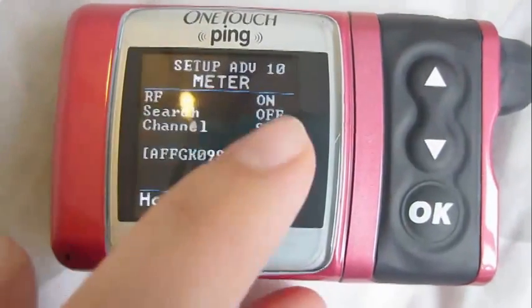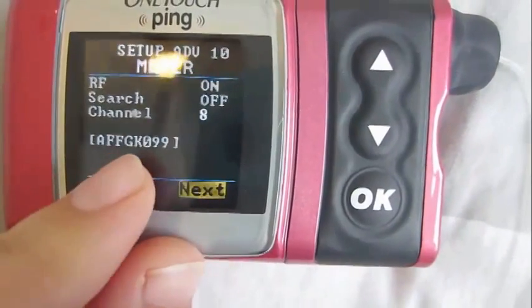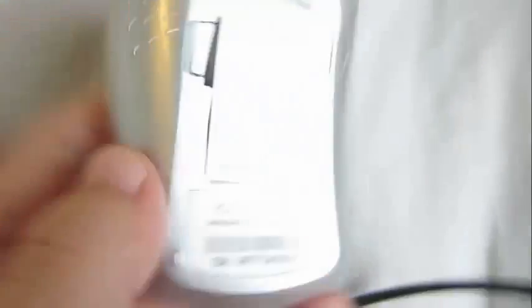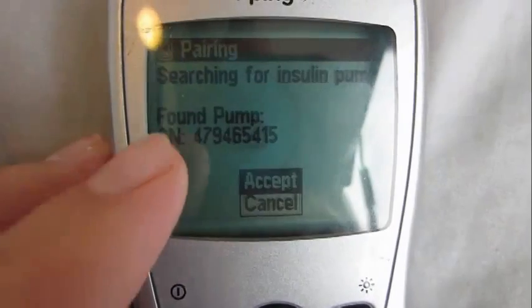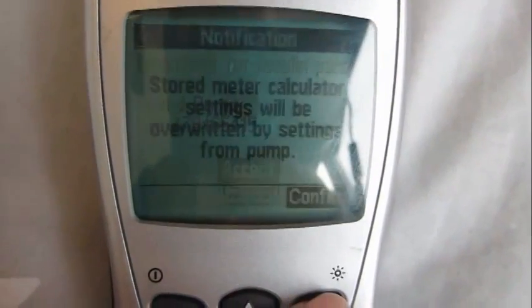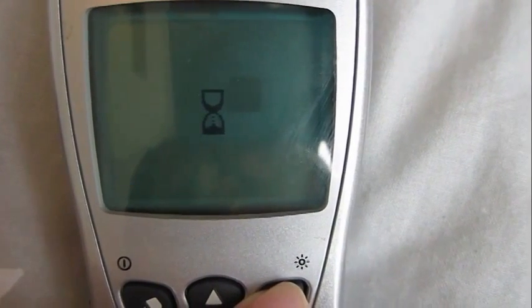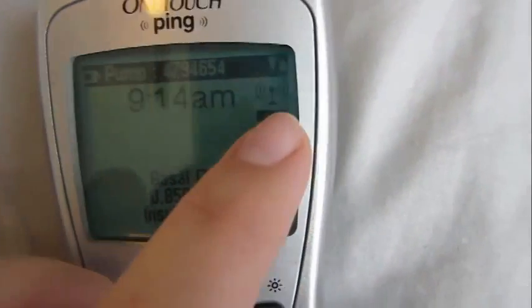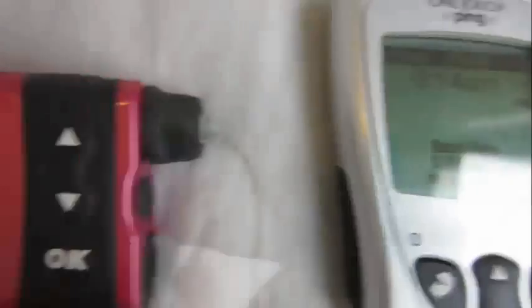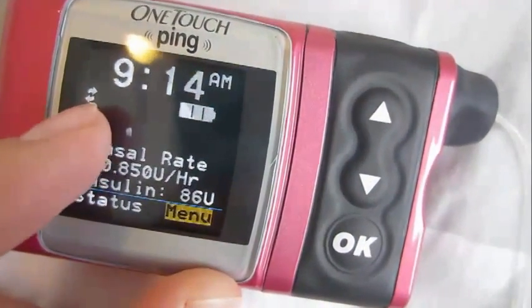Anyway, so now it says the RF is on, which is the search feature. Search is off because it already found the pump — it's on channel 8. And then this is the number of my meter. The serial number is on here, and then my pump's number is here. So now I accept it, and then the pump settings will be transferred over. And that's all — it's connected. It says the pump number at the top. If I go back to my home screen on my pump, that means it's connected to my meter.